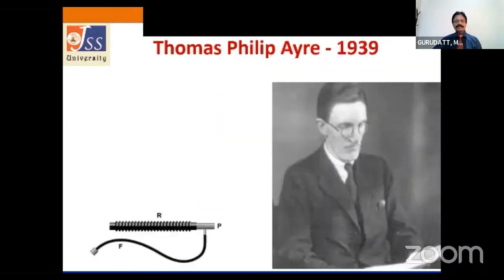But again, during those days, another problem was we had only either the Mapleson A circuit, that is the Magill circuit, the closed circuit, or the to and fro circuit. But for pediatric purposes, especially during those days, the common surgery done in pediatrics was cleft lip surgeries. If you connect these kinds of circuits, which were very heavy, the dislodgement of the endotracheal tube was very common because they used to drag on the endotracheal tube. So there was a requirement of a circuit which would not produce any dragging on the endotracheal tube that could be used in the pediatric age group.